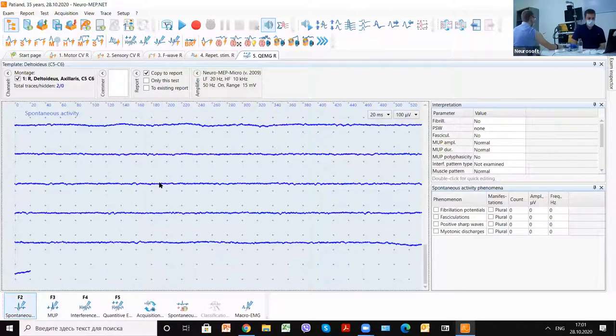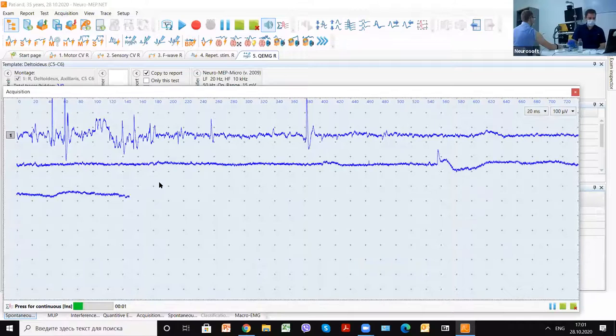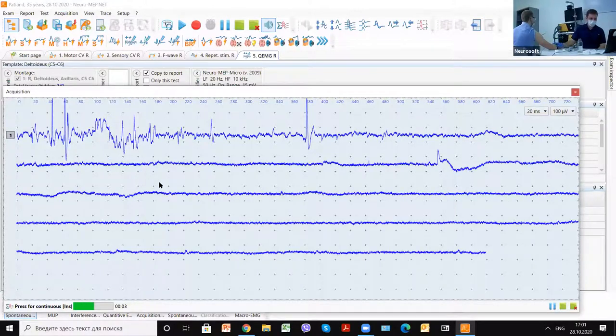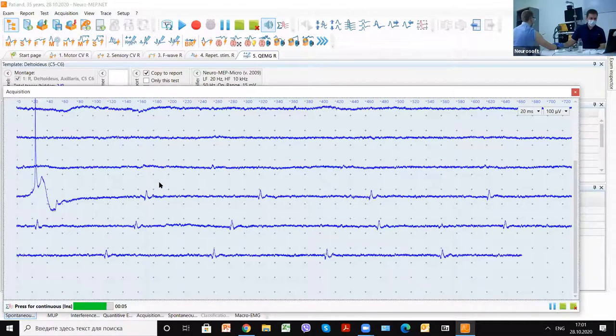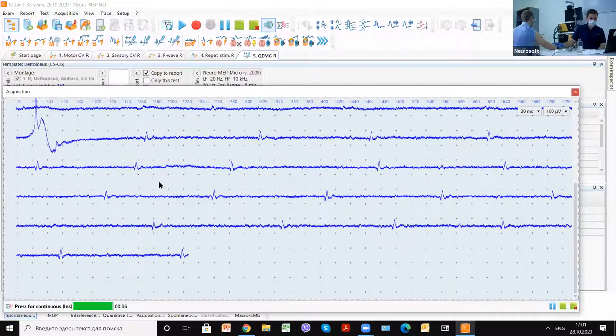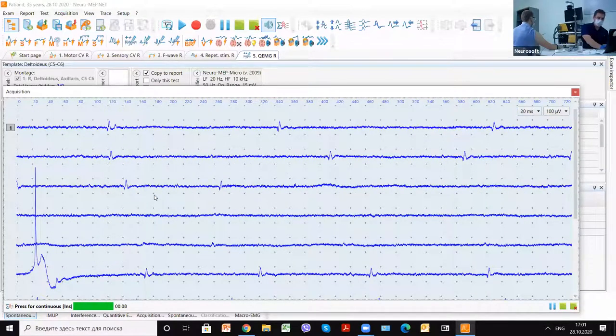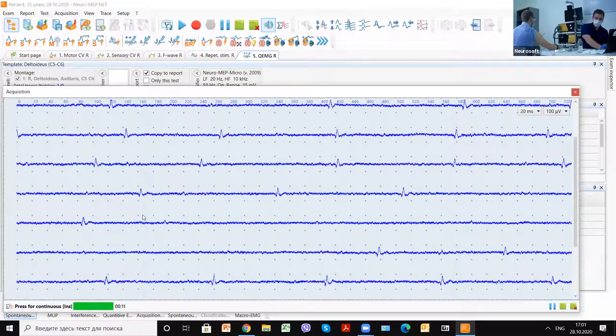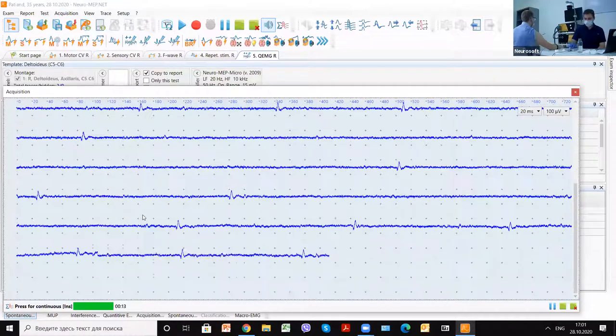Again, estimate the spontaneous activity. Please relax. We can see a little motor unit potentials, but it's not spontaneous activity.